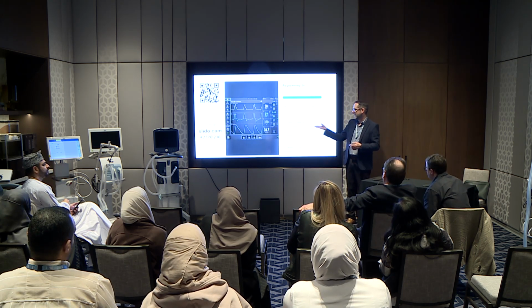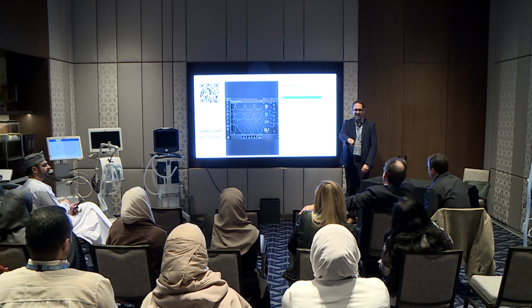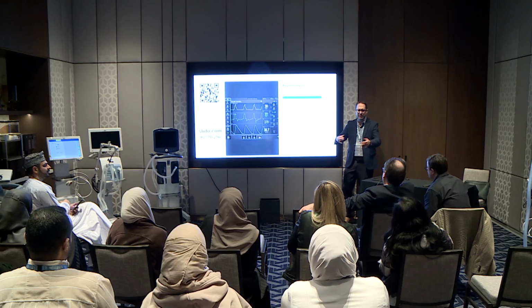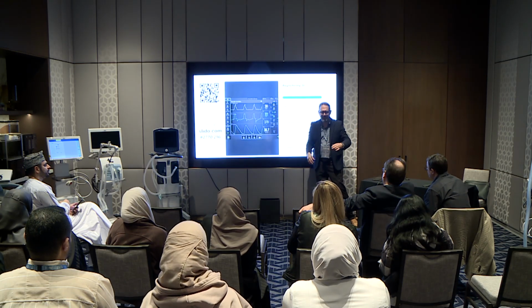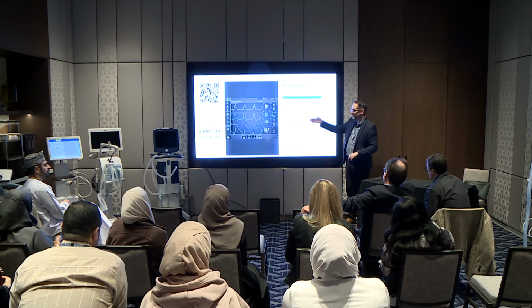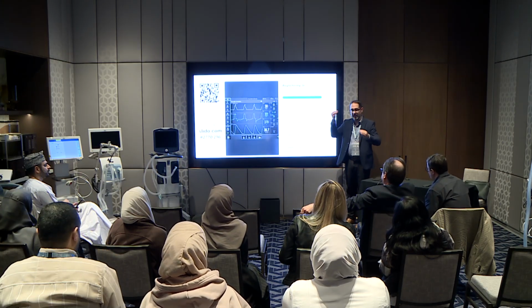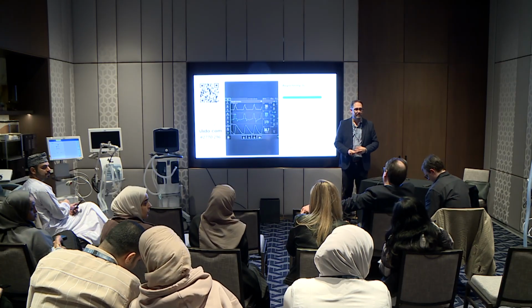Again, I only mentioned that I do this instead of this just because I don't like alarms. So I'll just stand there, turn my rate down to 10, and usually if I'm in the room, I'm doing other things, so I'll put the rate to 10, and then maybe I'll check the humidifier bag, I'll check my filter, whatever, and then I see, what are they breathing? But either one would determine whether or not they have an intact respiratory drive. This depends upon the ABG. This ABG is good. We will go.